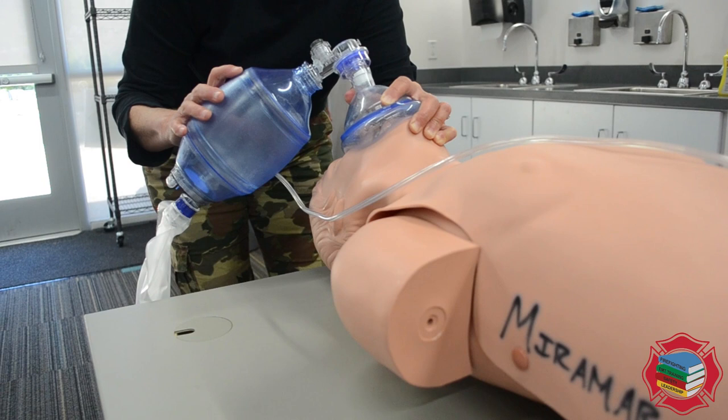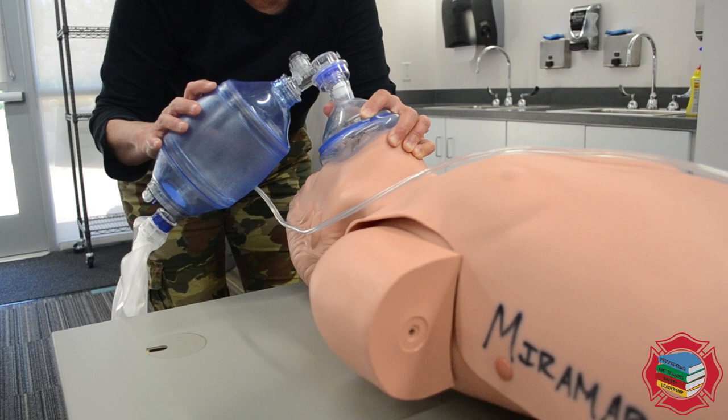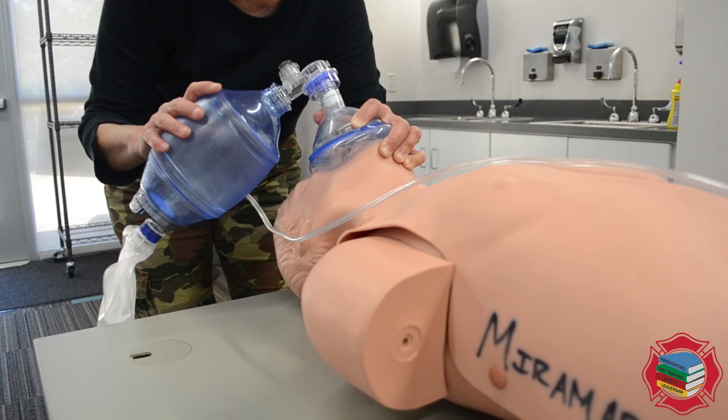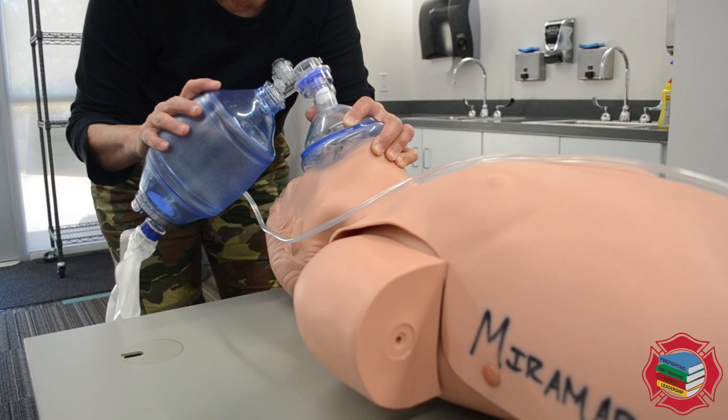Then we're going to give it a squeeze. After the first ventilation, we're going to deliver ventilations one breath every five to six seconds. Counting: 1-1000, 2-1000, 3-1000, 4-1000, 5-1000 — squeeze. Repeating the cycle, assuring that you get adequate chest rise.